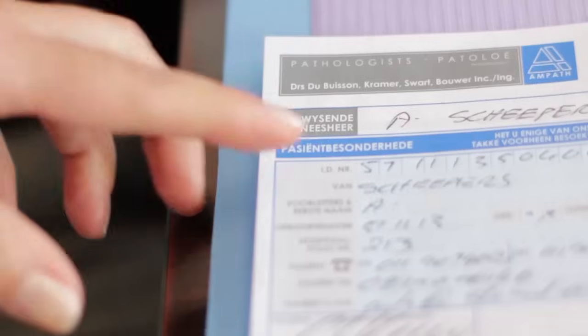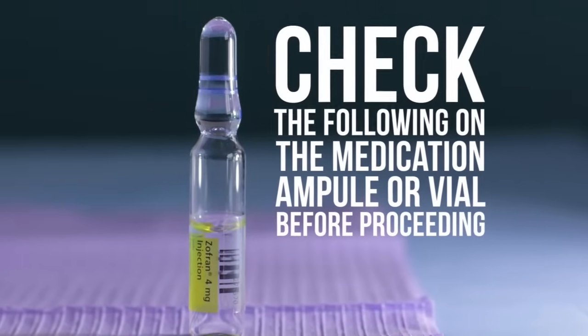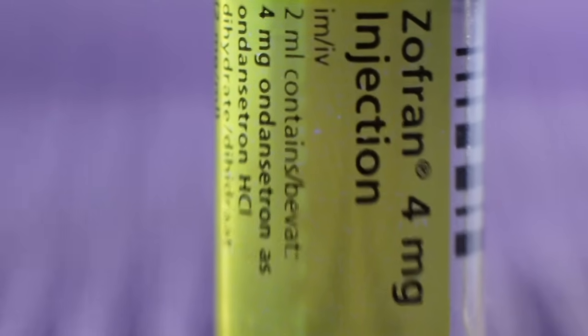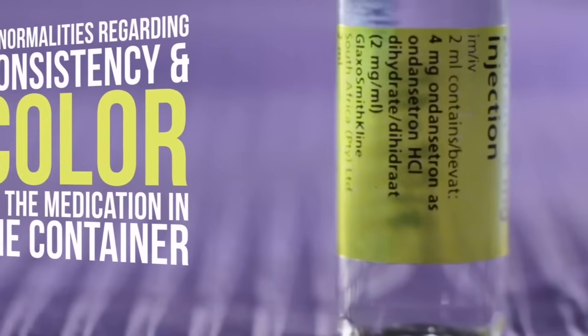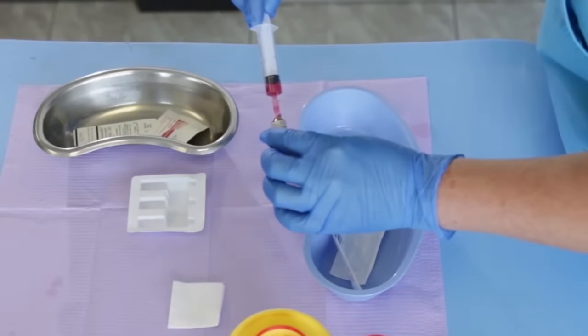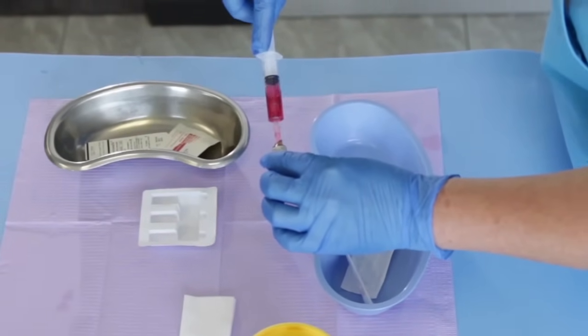Follow these steps. Greet and positively check the patient's identity. Check the following on the medication ampoule or vial before proceeding: the correct name, volume, and concentration of the medication; the expiration date; and any abnormalities regarding consistency and color of the medication in the vial. Draw up the medication for intramuscular injection as described in Project 6A.